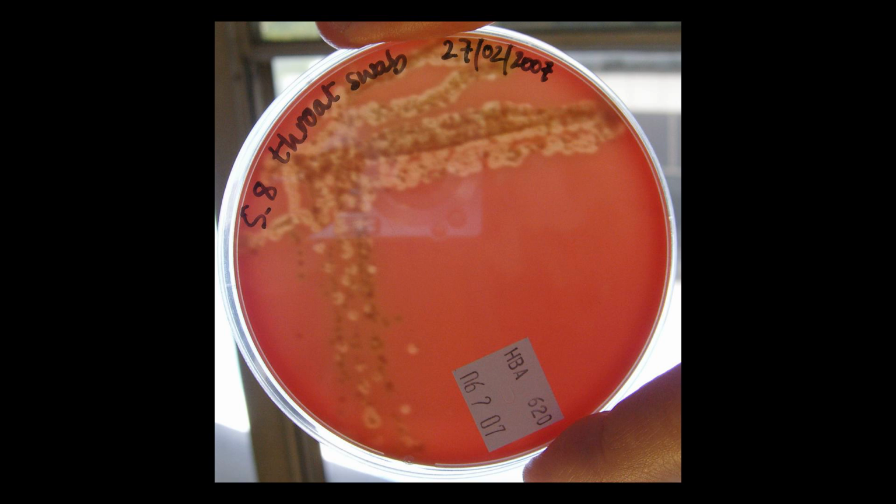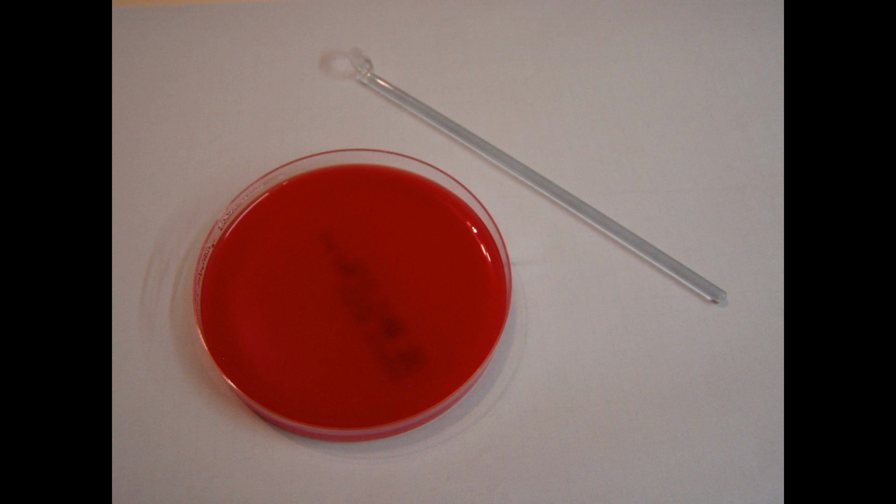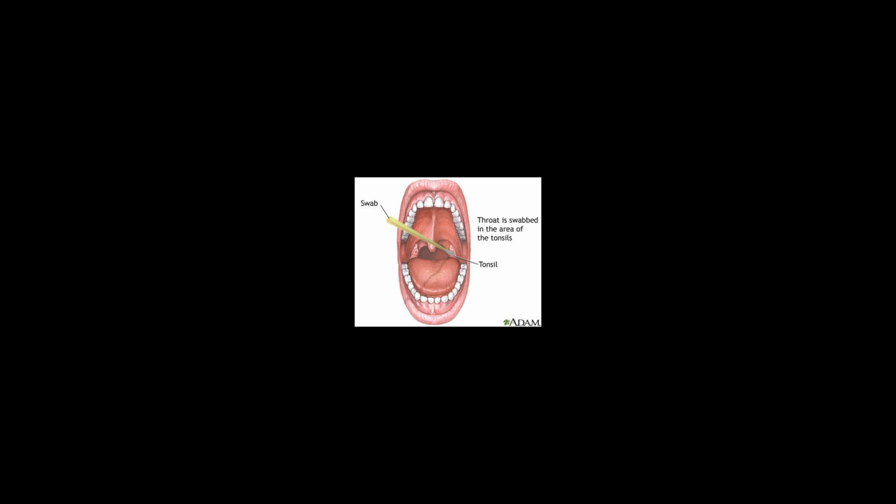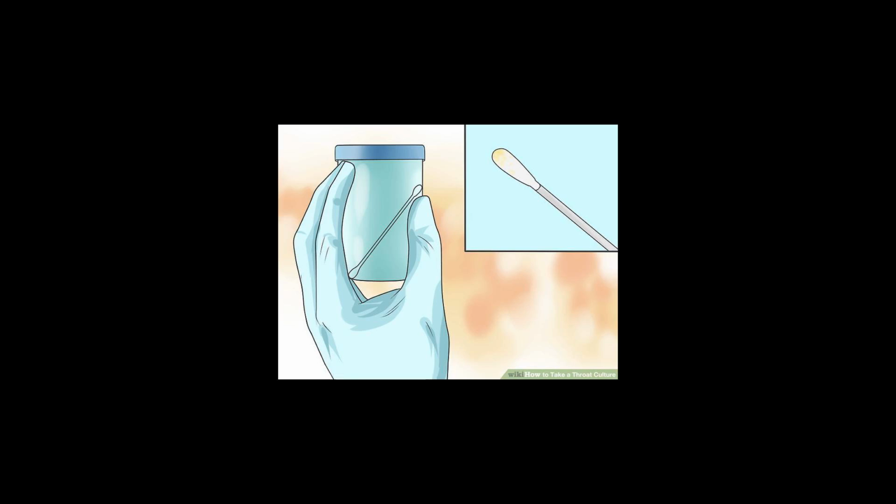Common infectious organisms tested for by a throat culture include Candida albicans, known for causing thrush, and group A streptococcus, known for causing strep throat, scarlet fever, and rheumatic fever. Throat cultures are more sensitive, 81% sensitive, than the rapid strep test, 70%, for diagnosing strep throat, but are nearly equal in terms of specificity.